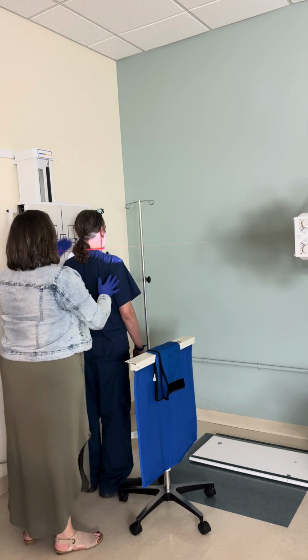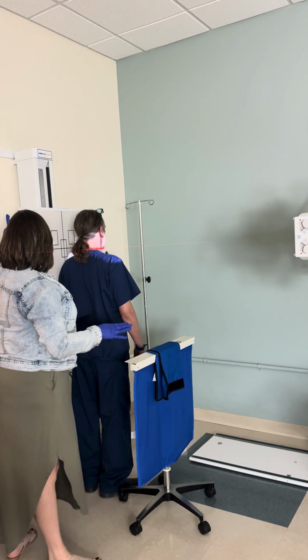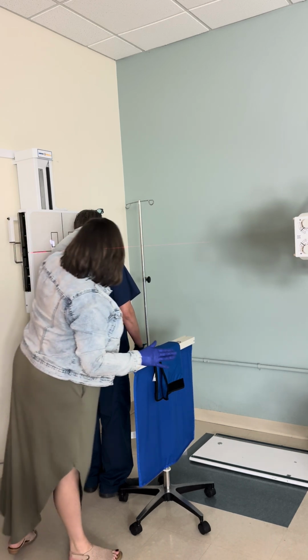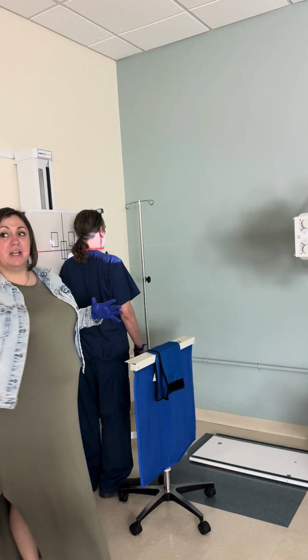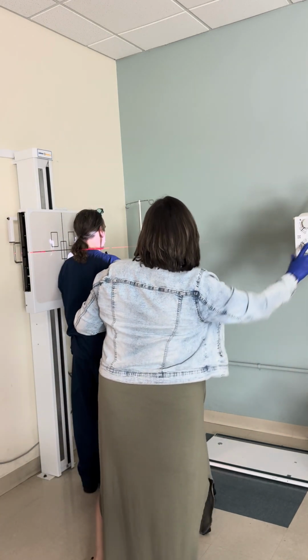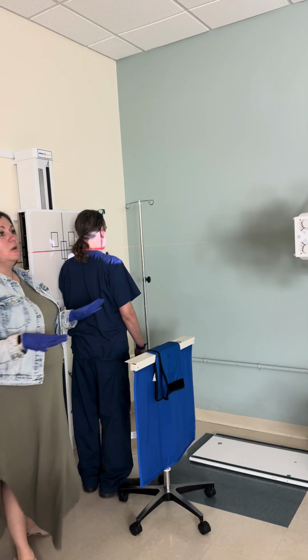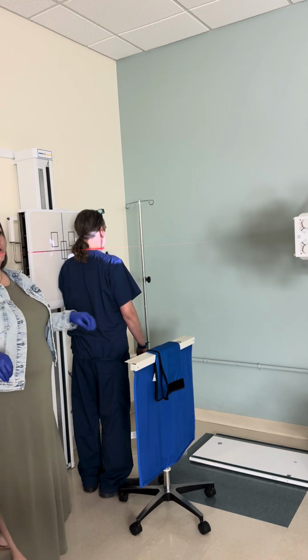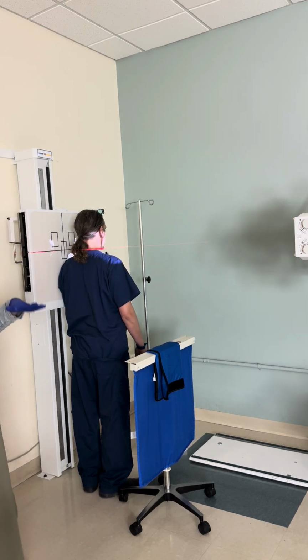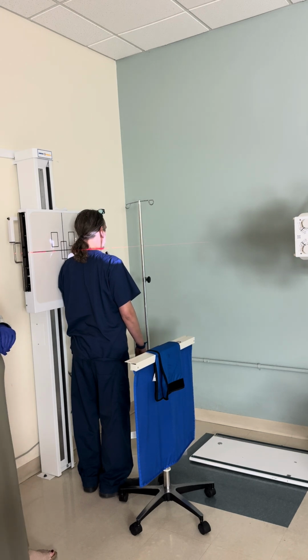So we're right there, have light field coming behind, and I'm gonna line this up. So no angle. We want to make sure we're seeing the EAM, which is the external auditory meatus, so the ear hole, okay? And then we have light coming down onto the shoulder. Over here more there. We're at the level of C4, and then we're going to tell our patient to relax their shoulders down, blow their air out, and hold it out. That expiration helps get the shoulders even lower, okay? And then, again, we're centered here at C4, coming through. My marker's there in the anterior portion, and that is my lateral C-spine.